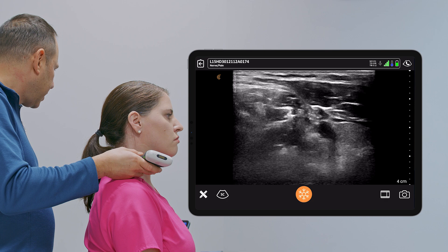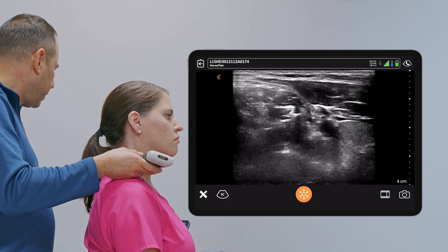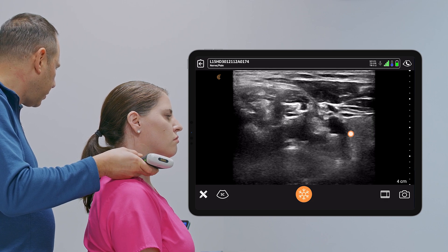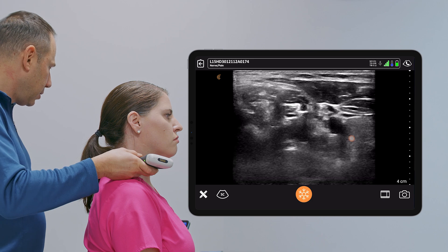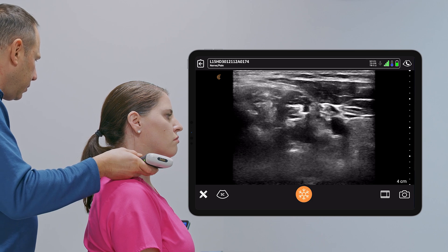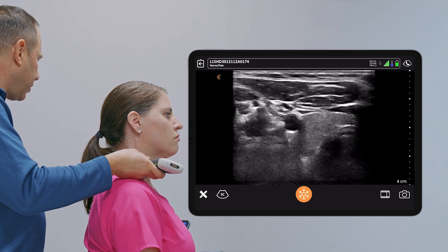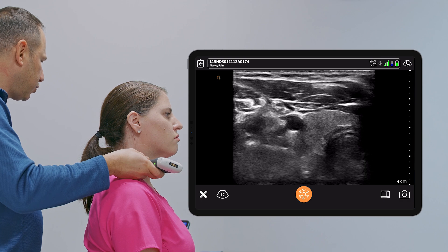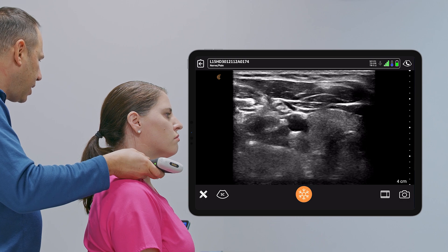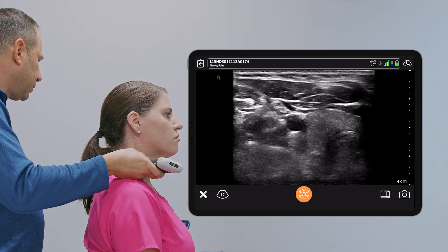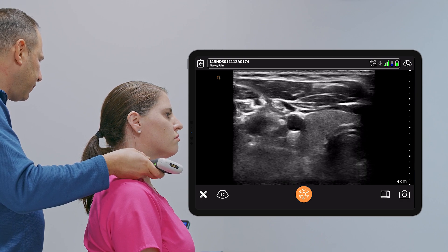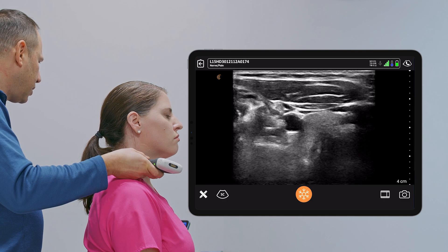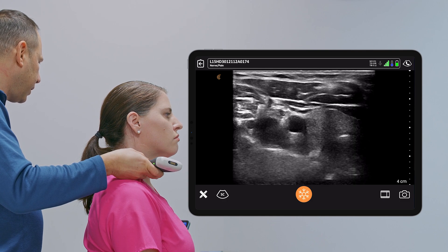The target for the stellate ganglion would be behind the carotid artery on top of the longus colli muscle, where you could either come laterally to medially, or come medial to laterally through the thyroid. As I look at the thyroid here with the trachea behind it, I don't see any major blood vessels, but the superior and inferior thyroid artery may come into view as I raise and lower my probe.